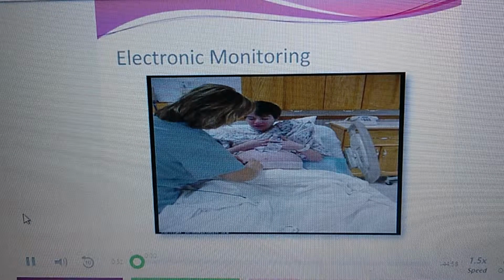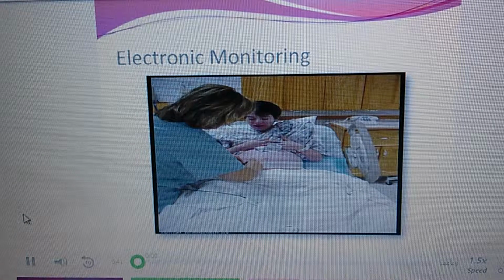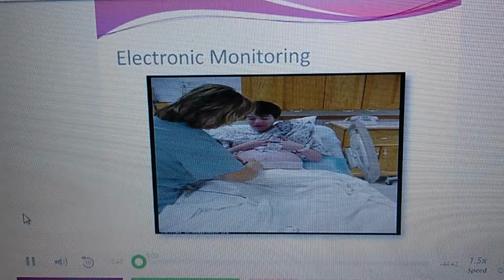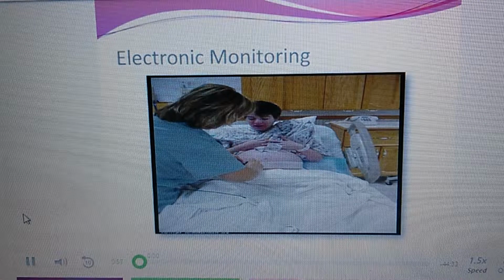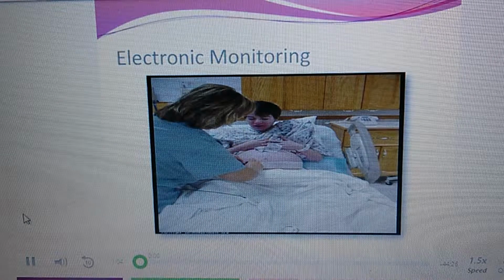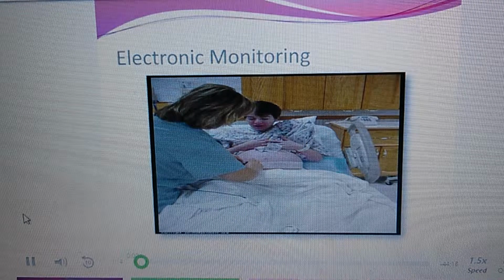And for those of you that have already started your OB rotation, you have seen moms put on the monitor, you've seen the devices that they use, and the pieces and elements that come together to make electronic fetal monitoring. Remembering you have an ultrasound, that is the flat surface that the gel is applied to transduce the fetal heart rate of the baby to the monitor. That goes on the portion of mom, typically the lower segment of the abdomen, if the baby is vertex, cephalic, or head down. All of those are interchangeable words.